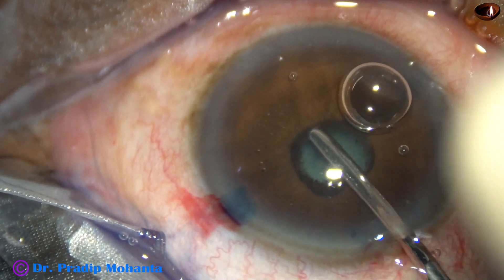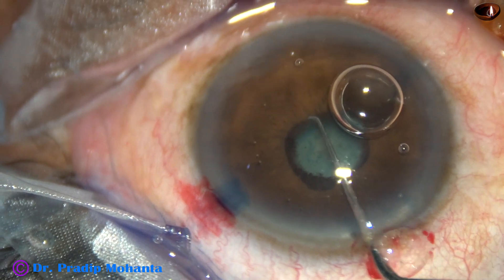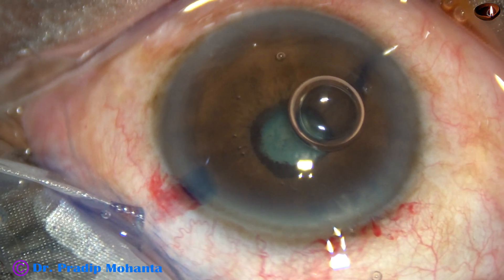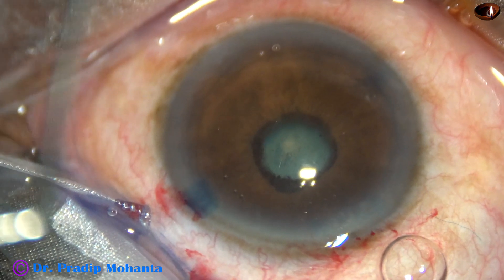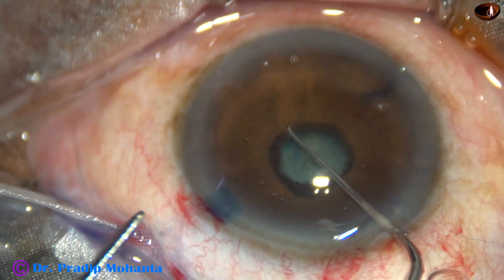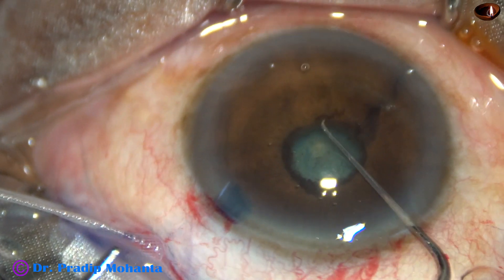I take the iris spatula and try to push the iris, but it is firmly attached to the anterior capsule of the cataract. I take the synechia hook but find that the air bubble is disturbing me, so I replace the air bubble with 2% HPMC. I take the synechia hook again and scratch the synechia and I could get a gap. I am careful not to damage the anterior capsule.